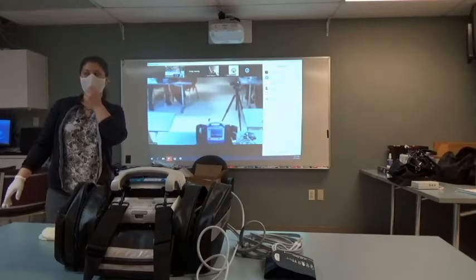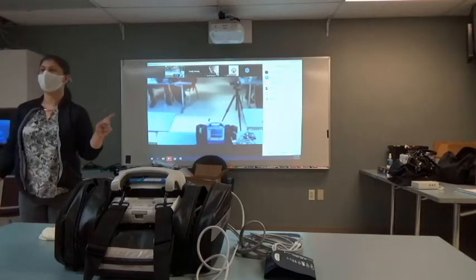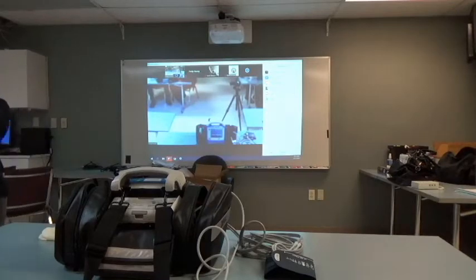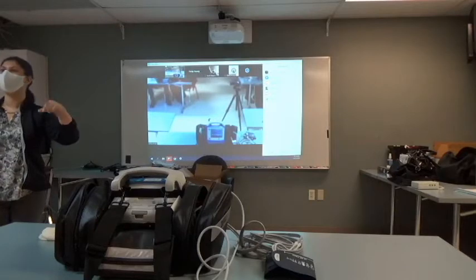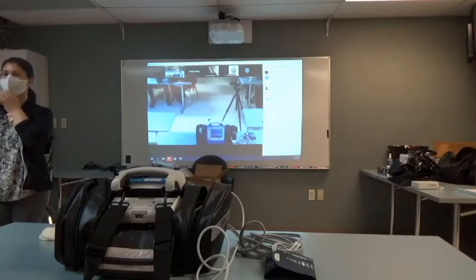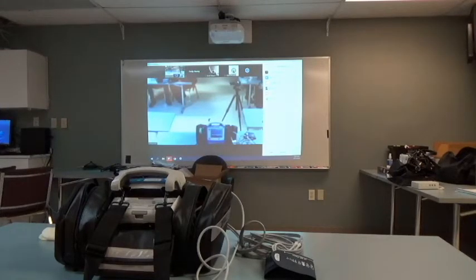All right. The next button push is the camera. The camera is unique. The camera button is a record button, but it's also a Back to the Future button. I'm sure we've all seen or heard of somebody who has seen a funky beat on the rhythm on the screen, and then you go, "Doc, I swear it was there." Well, when you press this button push, it'll actually capture it as long as you're in the time frame. For those of you that have a rhythm generator, pick a different rhythm and then press your camera button.